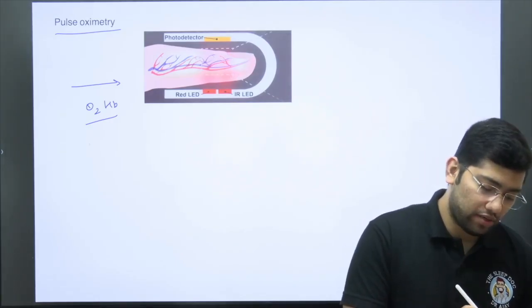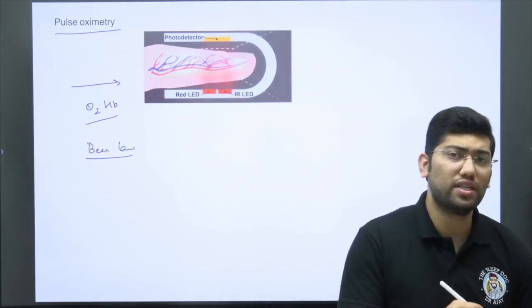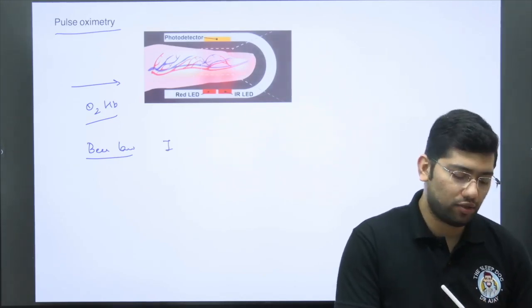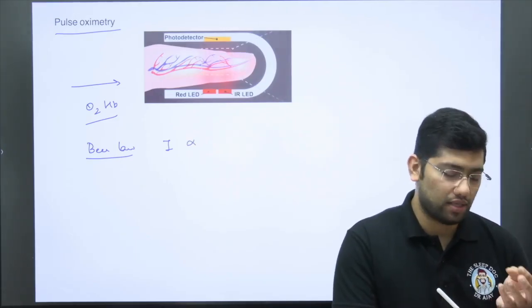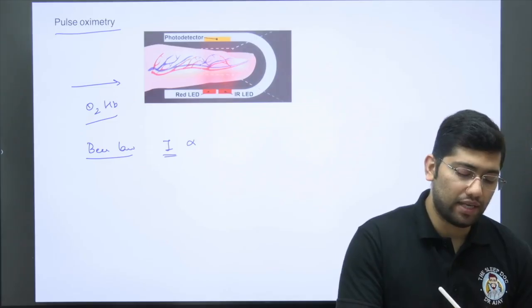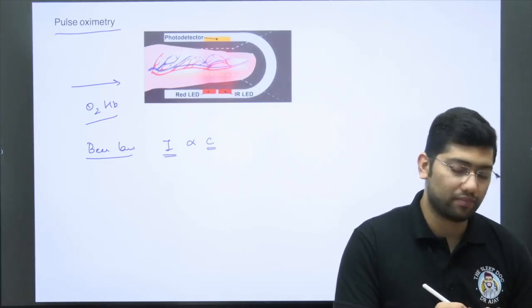So, first one we need to see here is Beer's law. So, what does Beer's law state? The absorbance of the transmitted light is directly proportional to the concentration of substance in the medium.